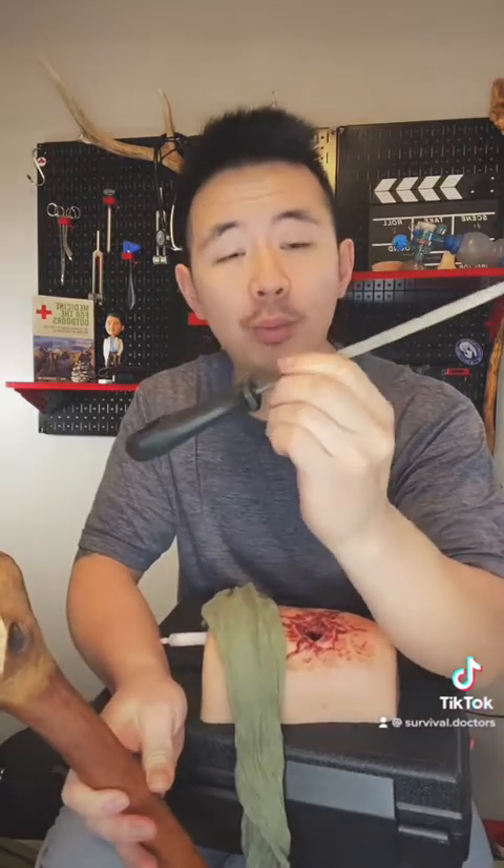Next, you're going to want to find a windlass — something like a stick that won't break, something made out of metal, something made out of wood. Or if you're really struggling to find something and time is key, everyone has a shoe. Most shoes are not compressible to a certain extent, so a shoe can serve as a windlass that you can turn and incorporate into your improvised tourniquet.